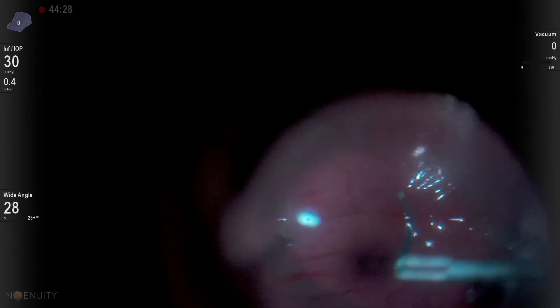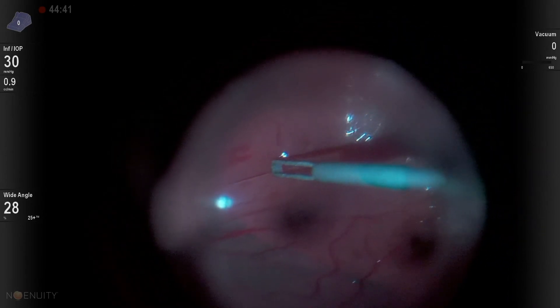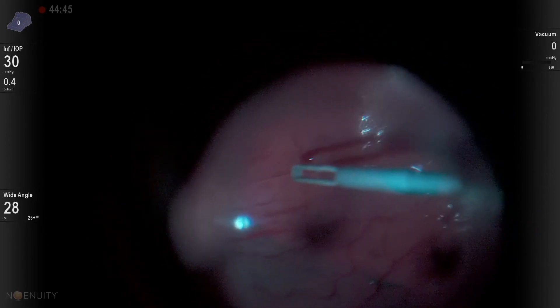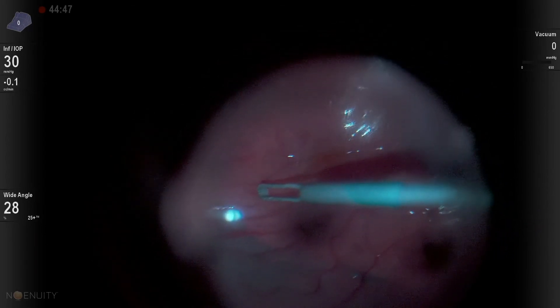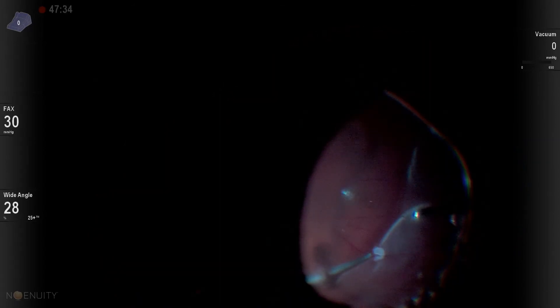And I've peeled several other cases under perfluoron, and I've been very happy with it. And it's something that I've added to my armamentarium. Here I'm just kind of stroking the retinal surface where the fold is just to get out any little final bits of retinal fold that are present.